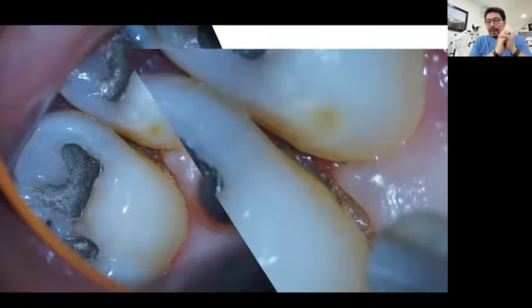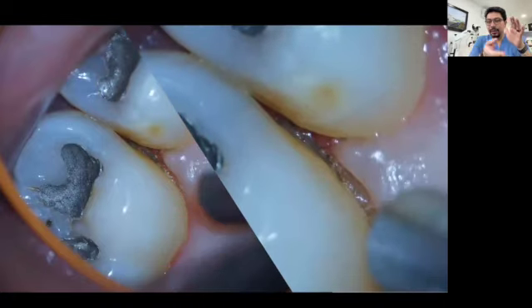Or you can take one of those pictures, showing the patient how bad it looks in the area. You can show the patient the inflammation that is being generated, and I'm 100% sure that every patient will want to get it removed from in between the teeth, because it's not nice to see that. You can see it looks disgusting, but the only chance of having this type of pictures is if you have these images in high magnification.